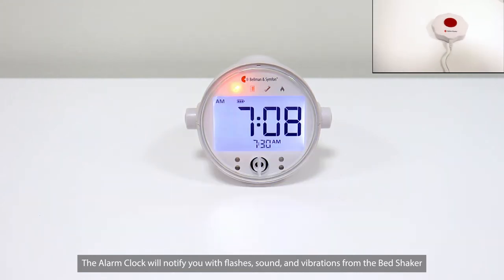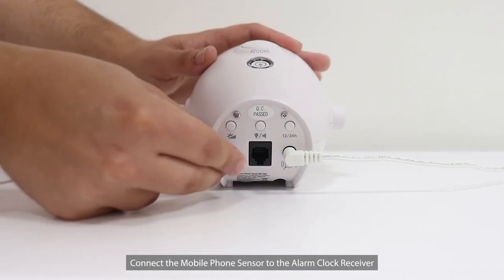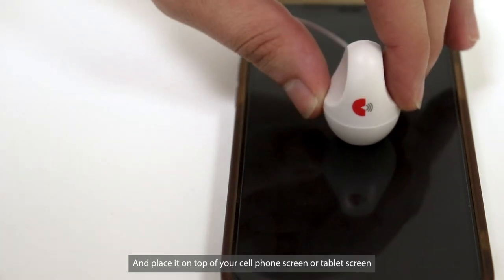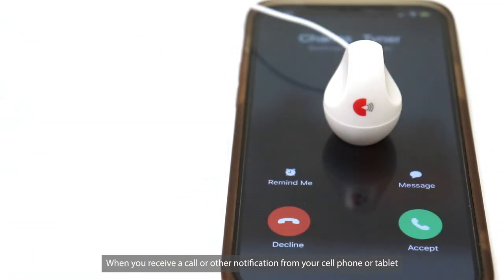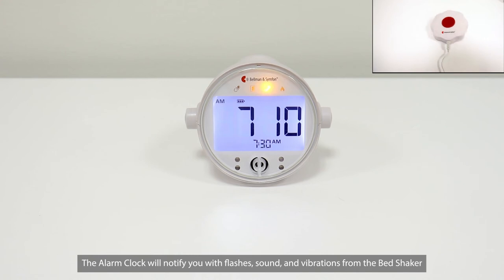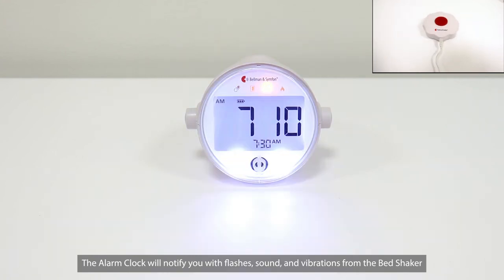and vibrations from the bed shaker. Connect the mobile phone sensor to the alarm clock receiver and place it on top of your cell phone screen or tablet screen. When you receive a call or other notification from your cell phone or tablet, the alarm clock receiver will notify you with flashes, sound, and vibrations from the bed shaker.